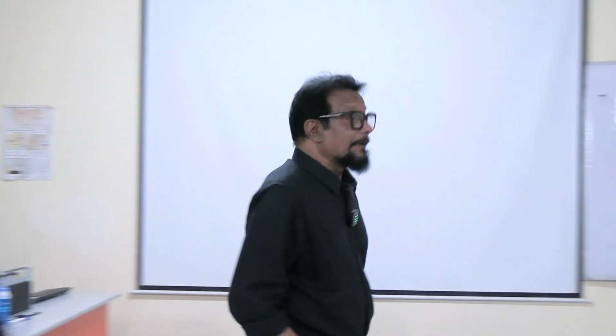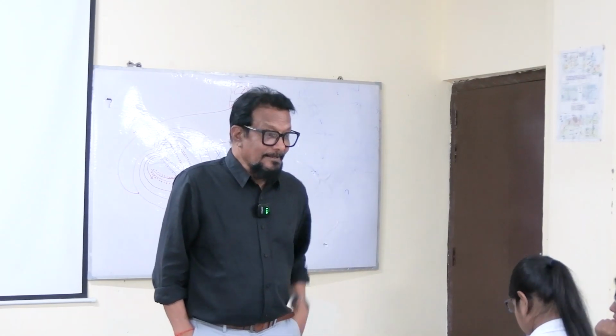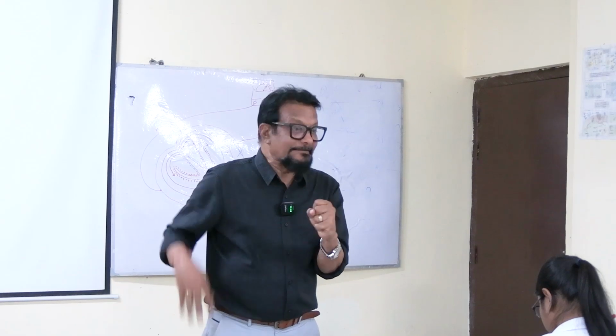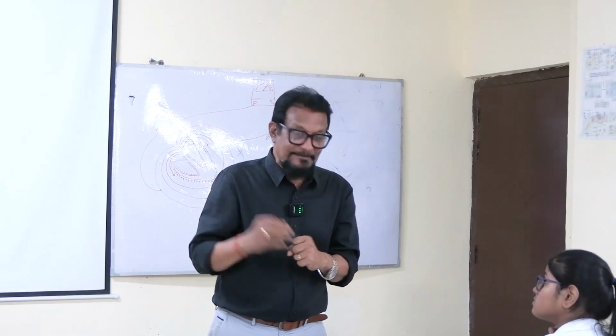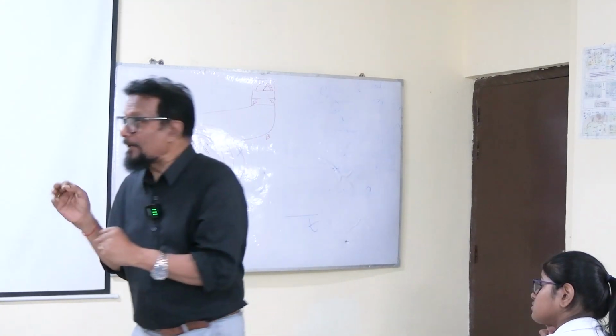Precordial leads. Precordial leads are also unipolar leads. Here also all the negative poles are together. The only thing is that the positive pole is exploring. It is the exploring electrode. It will explore my heart from different positions, and the other electrodes are fixed at a particular point.